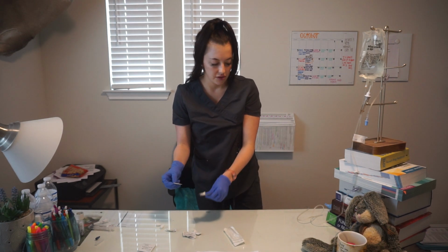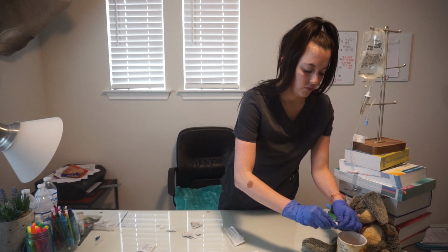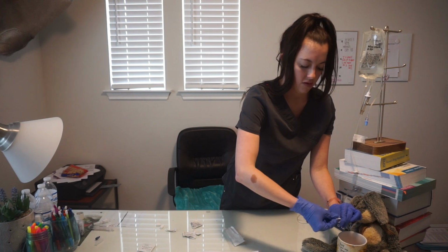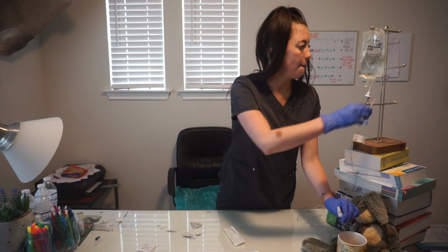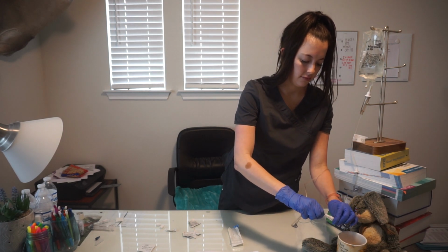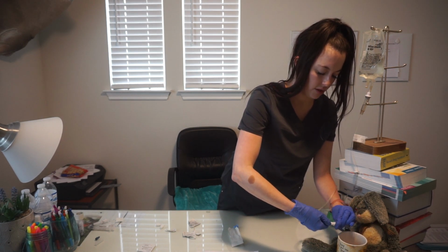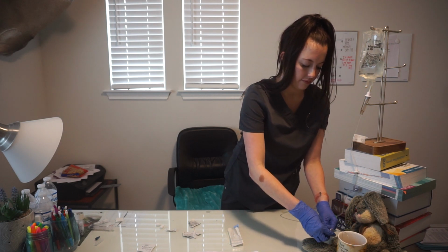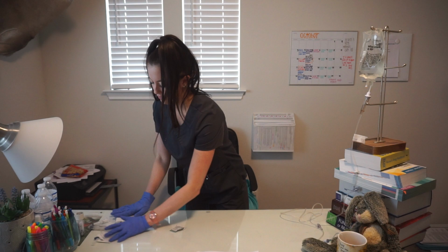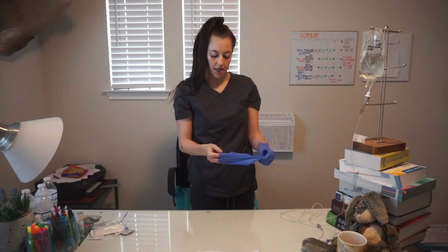Okay, now I'm going to give you your D5 half normal saline. And I'm going to run it at 100 milliliters per hour. Okay. There we go. Alrighty. Trash. Okay, Mr. Moore, that is all for today.